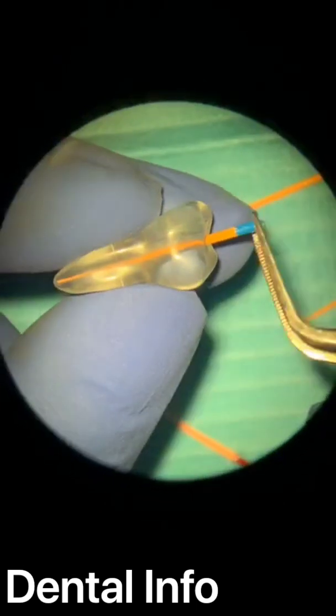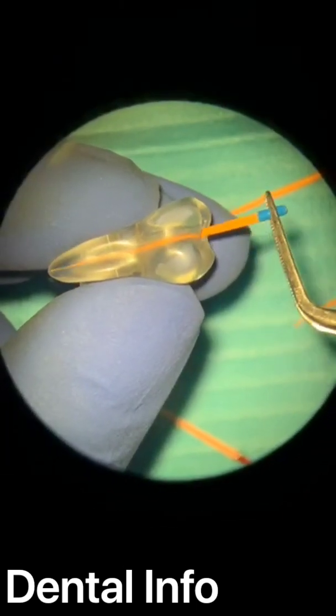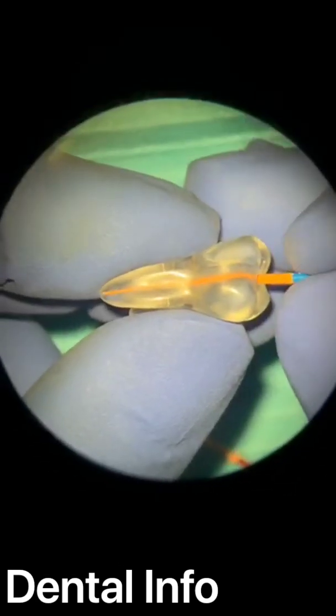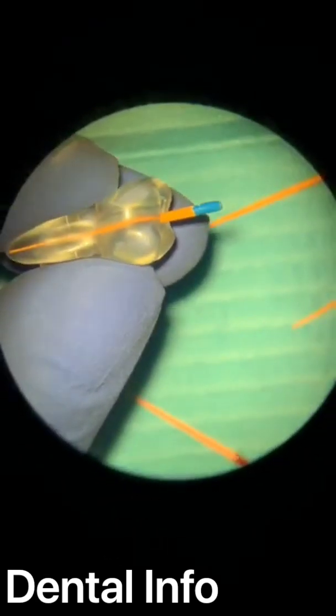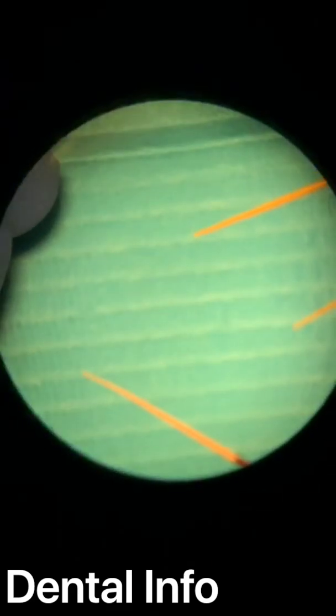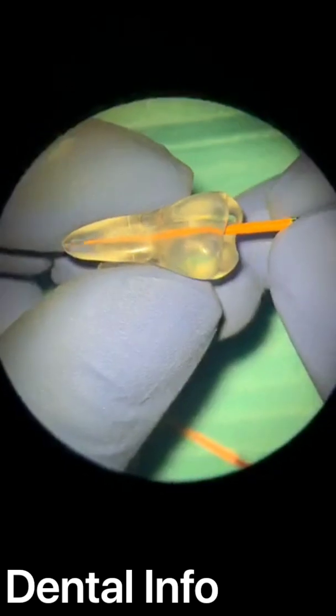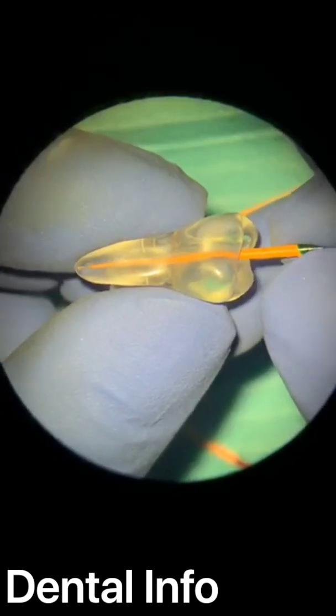So I'm taking the 30 taper 4 with very good tugback. I can feel it now. And I will, 3504. And I feel it now. It's a very strong tugback.